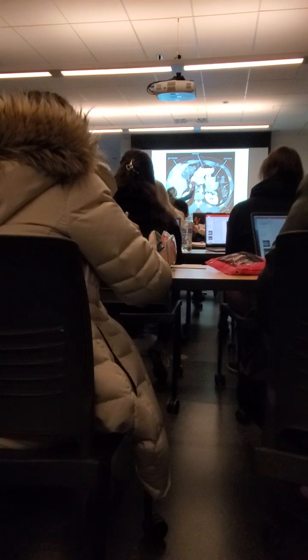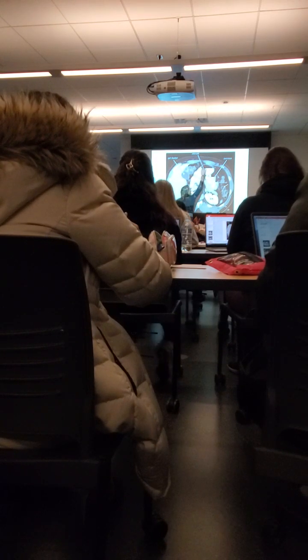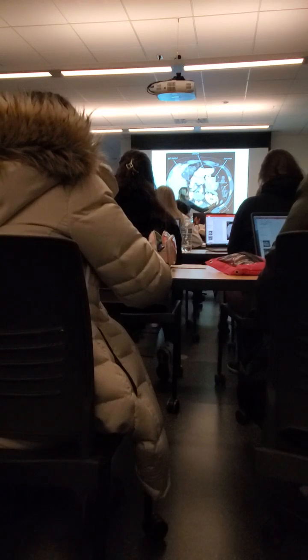Okay, so here we are. Liver again, gallbladder, seeing a little bit of stomach, some material in the stomach, a little bit of air. Here's intestines. So we have our left kidney here and our right kidney on this side. Now here's our little triangle of an adrenal gland. We're kind of down at kidney med. Go ahead, Mark. No, keep going, sorry. We're going to move up just a little bit here in just a second to see the adrenals.